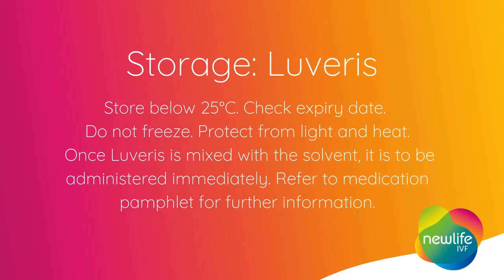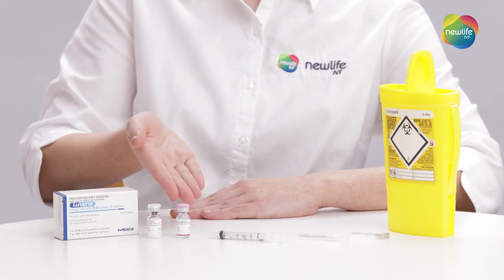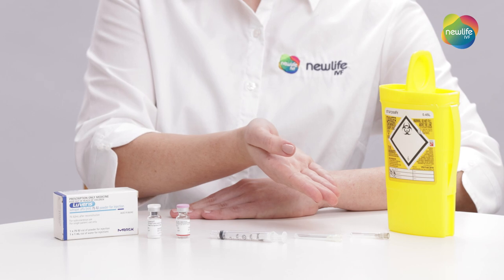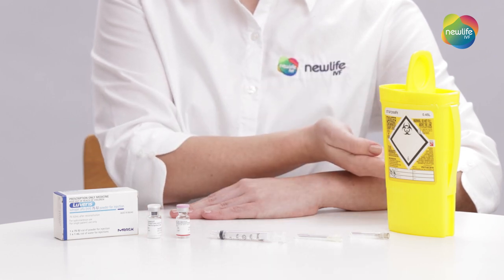Before we begin, let's prepare. You'll need your Levaris powdered vial, water or solvent for mixing, a syringe, the larger needle for preparing the medication, the smaller fine needle for administering your medication, and your sharps container.